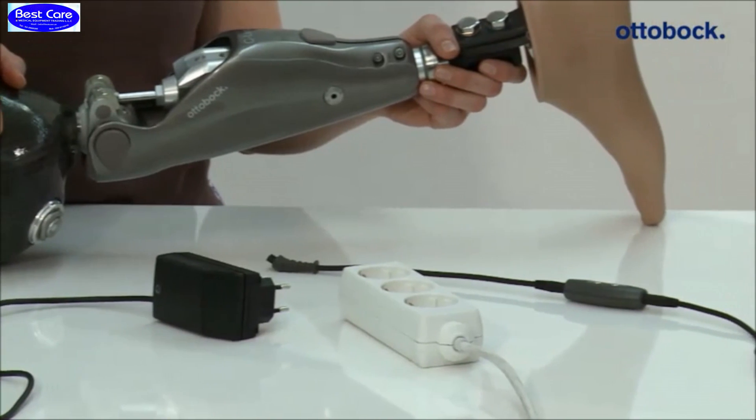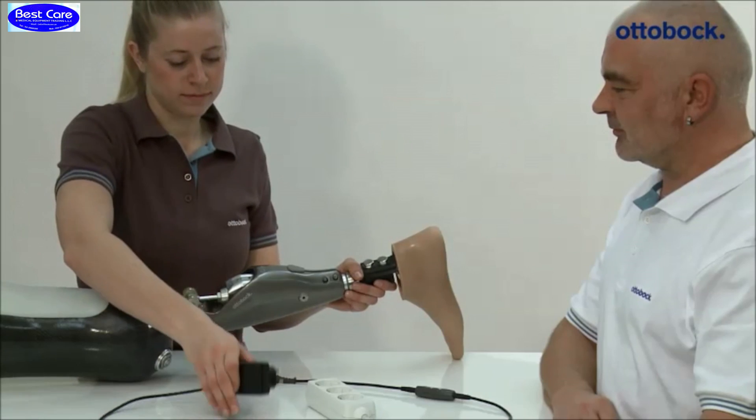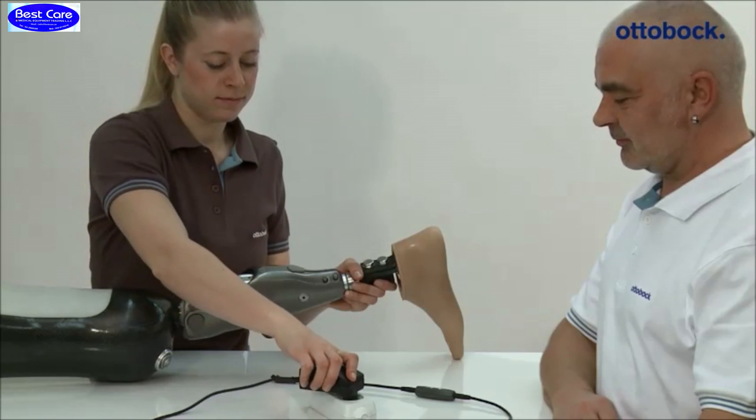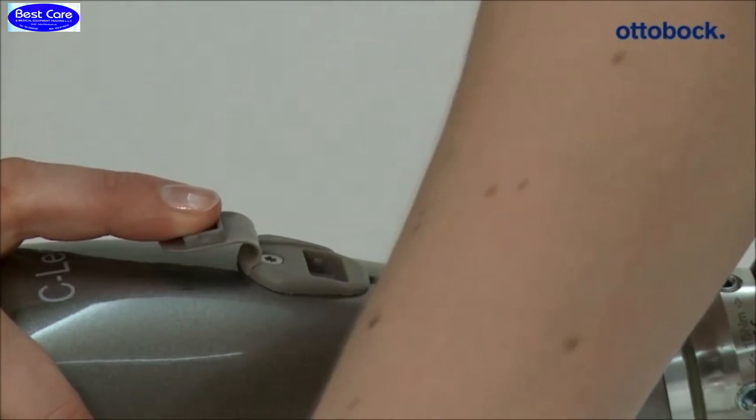After connecting the charger, the knee joint emits a beep signal, and shortly after that a three-times vibration signal. If there are no feedback signals, the joint is not charged. In this case, check if the charger was connected correctly.